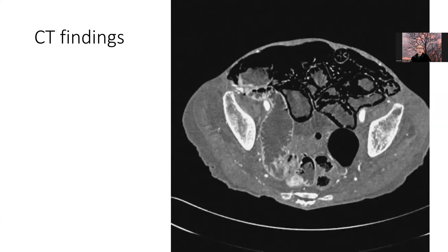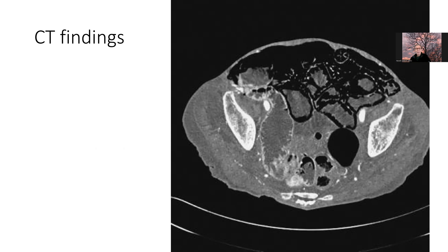Here's a representative view from a CT scan showing what was seen. As you can see, there's a lot of black space here that seems to track around structures — segments of bowel — highlighting them, and that has the same density as the surrounding airspace. This radiographically is fairly characteristic of pneumatosis, and there are a number of things that have been identified clinically as being associated with this.